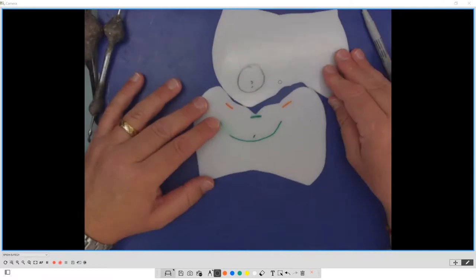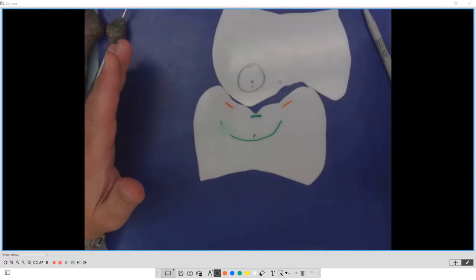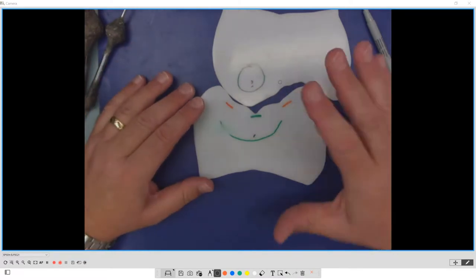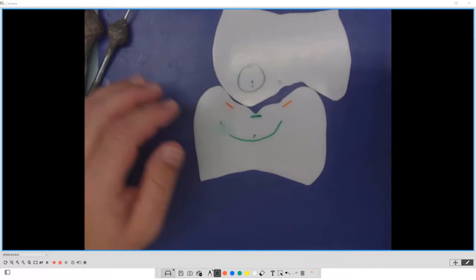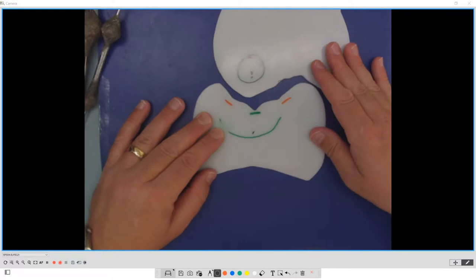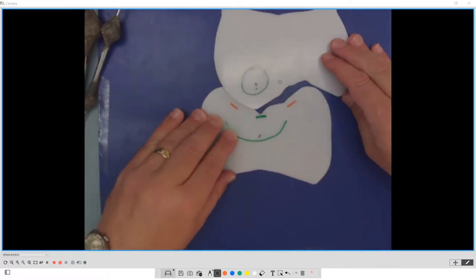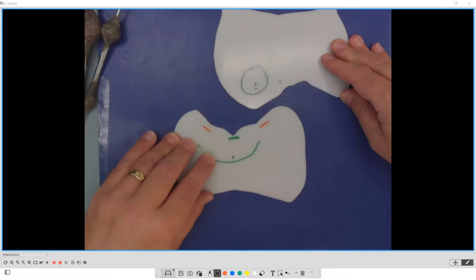So I wanted to show this quickly, again, to use it as a demonstration tool to show our milling and the fact that we have to hold them together and then have it touch is now a horizontal movement, and you're asking that patient to go horizontal to be able to chew.